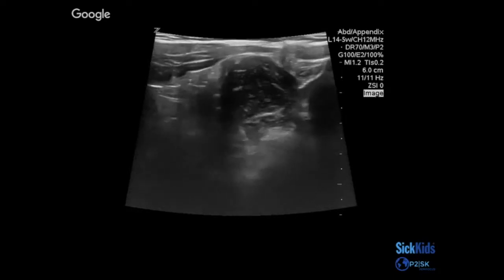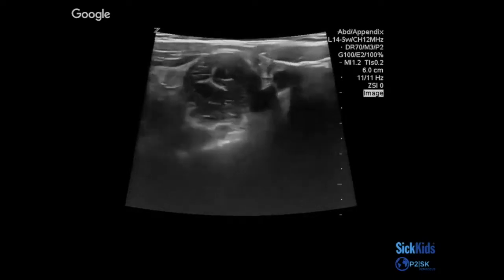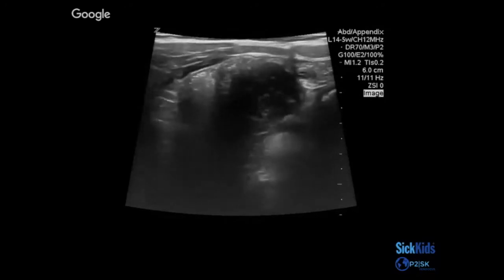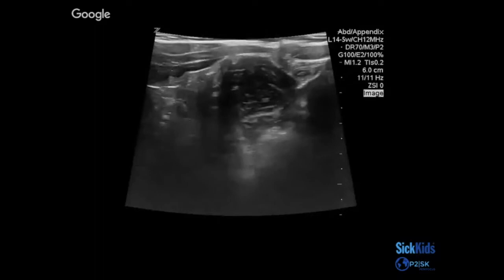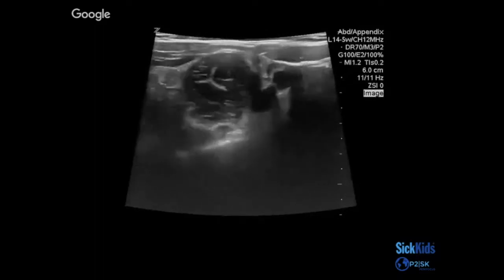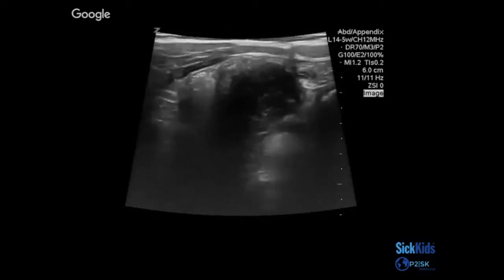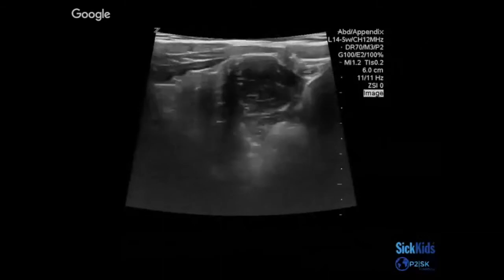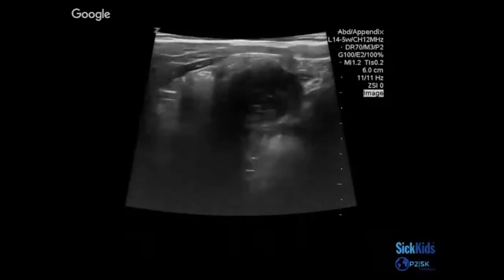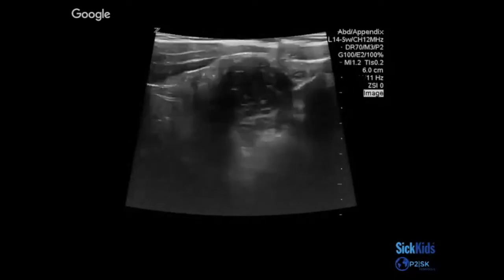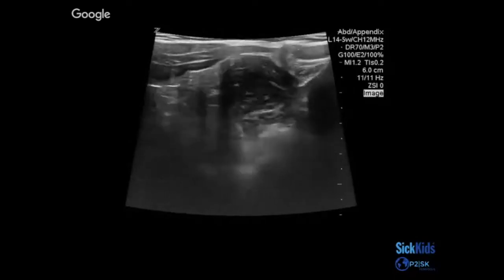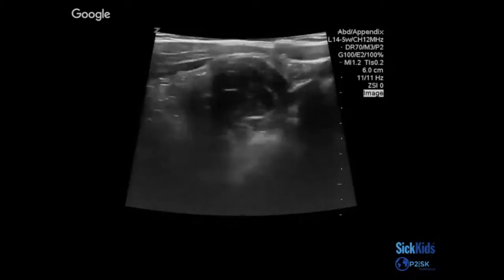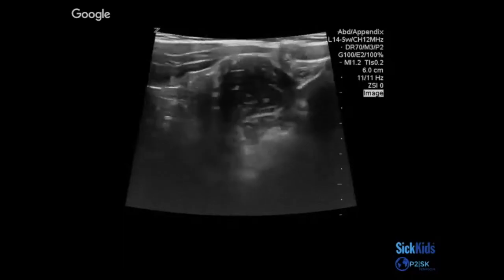Alexandra calls the next image abnormal, pointing to what she thinks is abnormal fat. She describes seeing muscle, a shadow with some bowel gas on the left side, and vessels on the right. After consideration, she calls it normal.